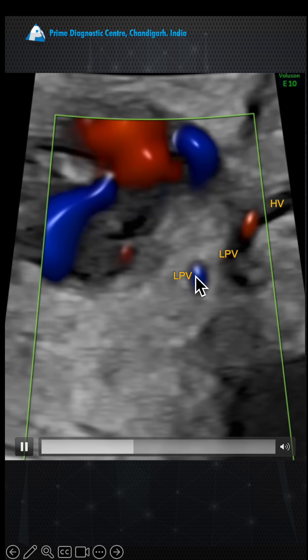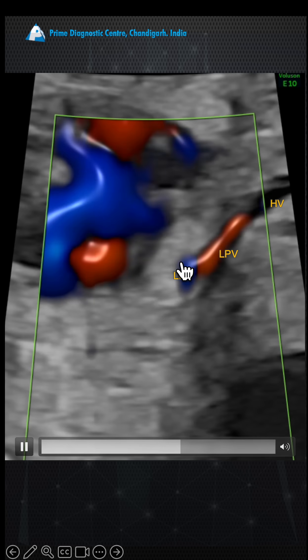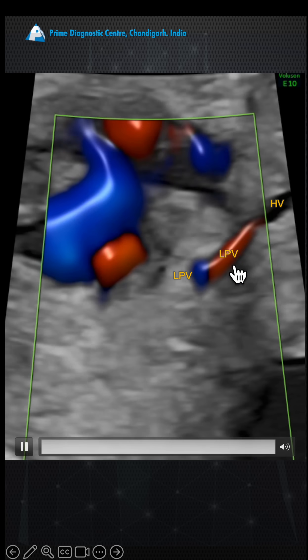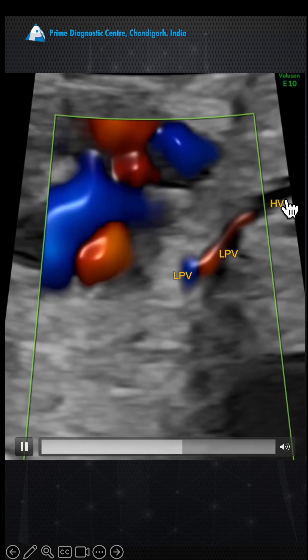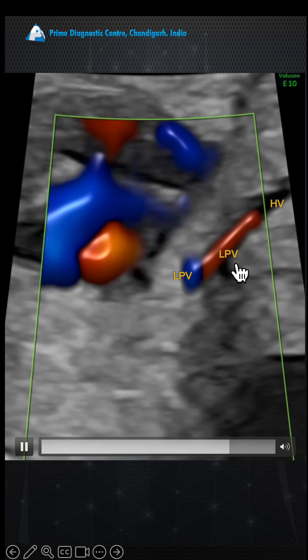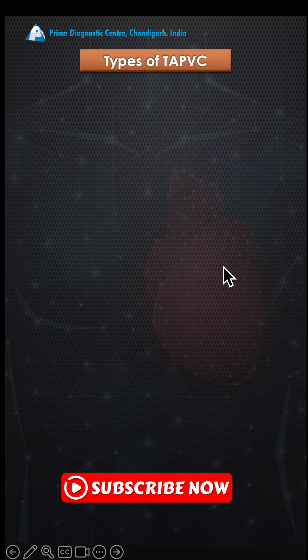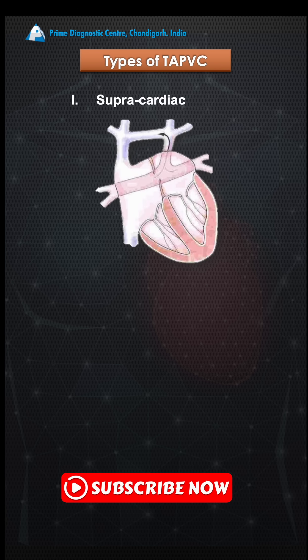We suspected a mixed TAPVC, and we were right. This is the left pulmonary vein crossing the diaphragm and entering into the hepatic vein — this is the infracardiac component. So this patient has both a supracardiac and an infracardiac type of TAPVC, which is called a mixed TAPVC.